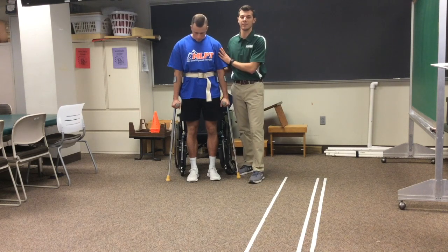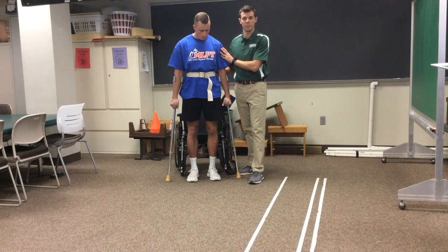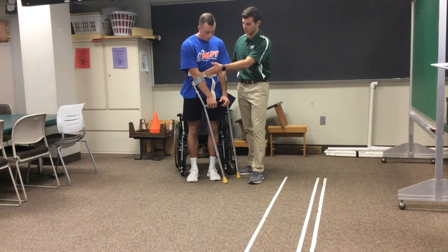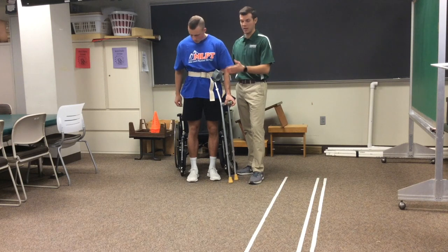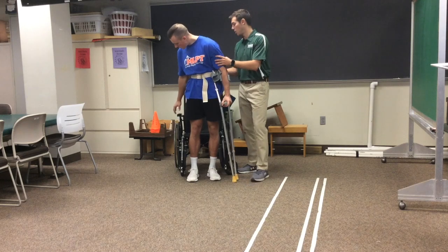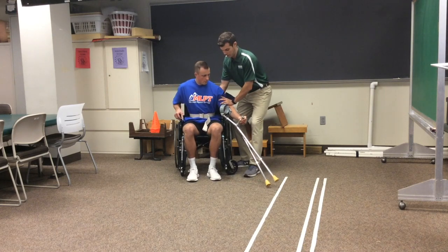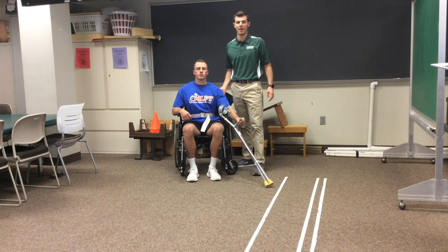Now we want Josh to transfer the Lofstrand crutches into one arm. And if that side is impaired, he's going to bring both crutches into the impaired side of the body. So he's going to transfer the right crutch into the left arm. Now he's going to bring the right strong side of the body and put his right hand on the wheelchair seat, and gently lower himself. All the while I'm maintaining hold of the gait belt, lowering him down. He can adjust to a comfortable position, and we're all good.